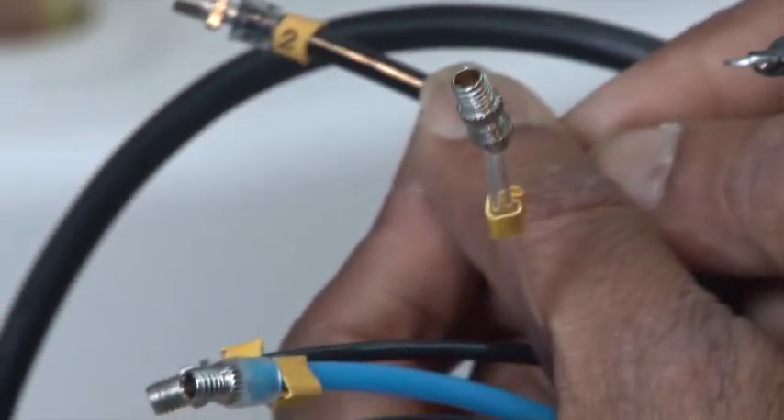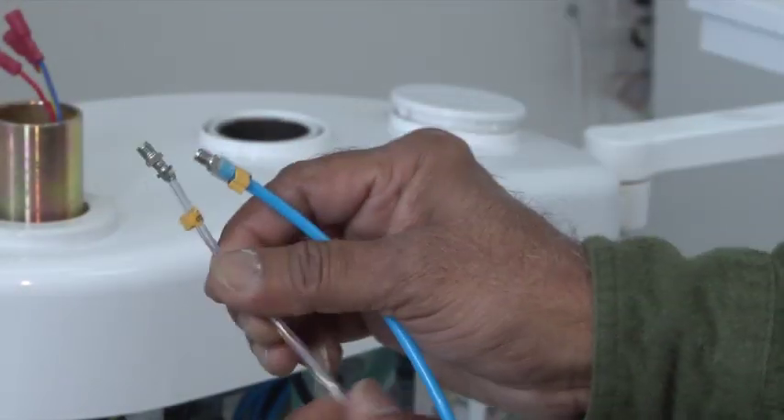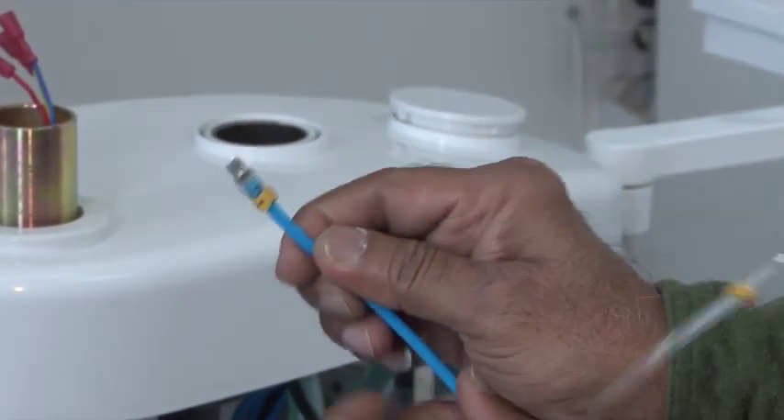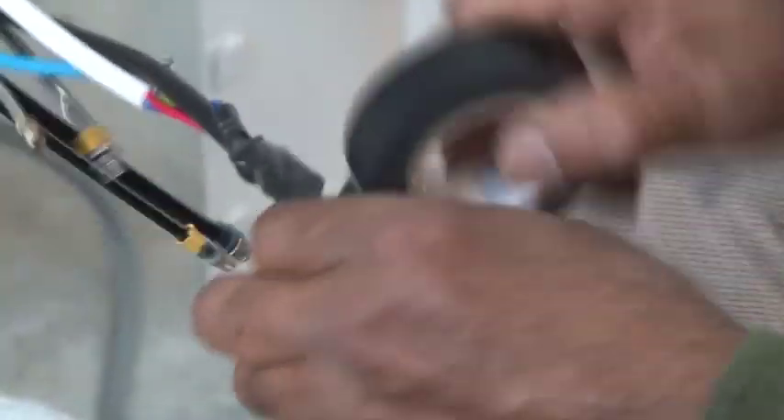Identify the tubing and wires that come out of the delivery tray. Each one of them is numbered or color-coded in order for you to connect to the corresponding tubing inside the delivery box. It is recommended that you tape all the tubing and wires to prevent damage while inserting through the pole holder.